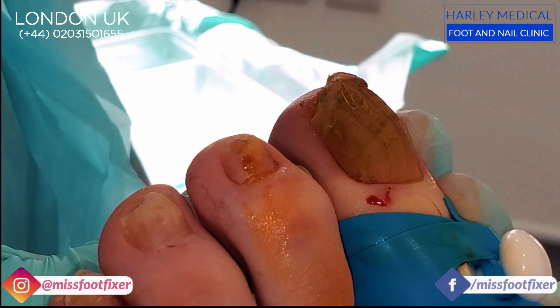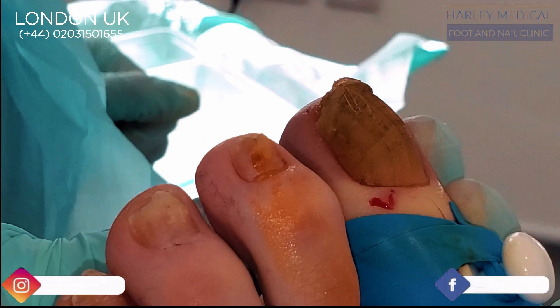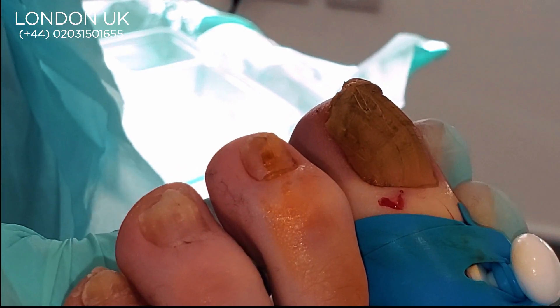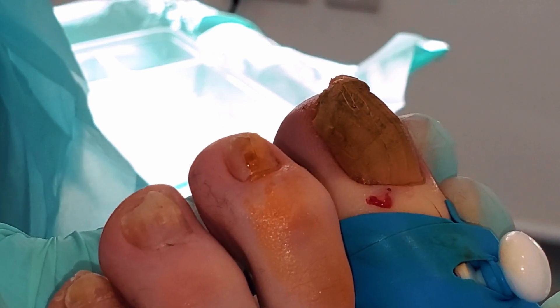Hello everybody, this is Miss Foot Fixer — hope you guys are well. We have this lovely patient here, a very lovely gentleman, who wanted his big toenails removed, and that is what we're going to do.